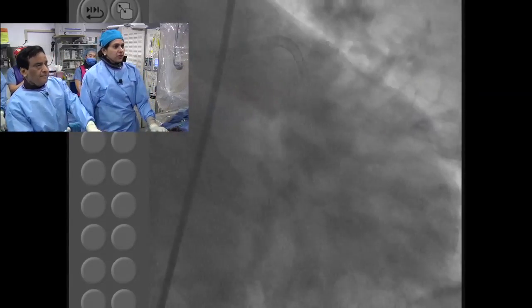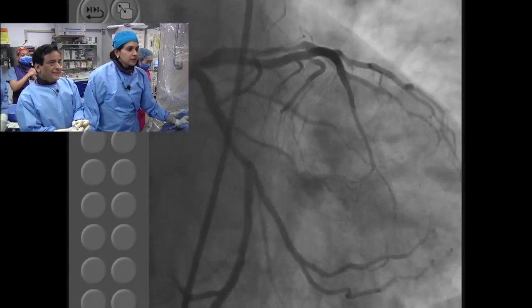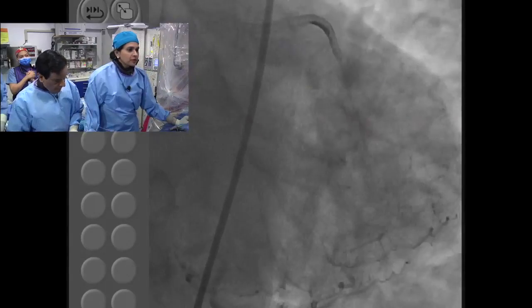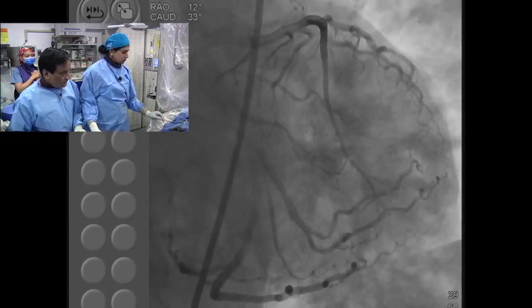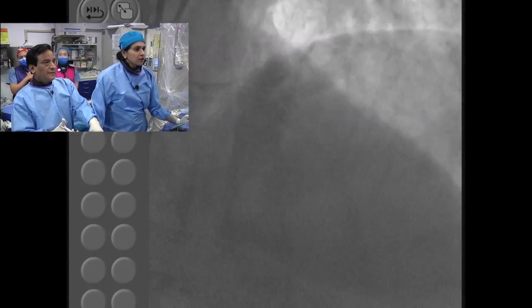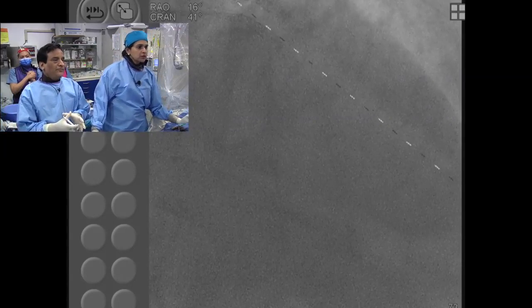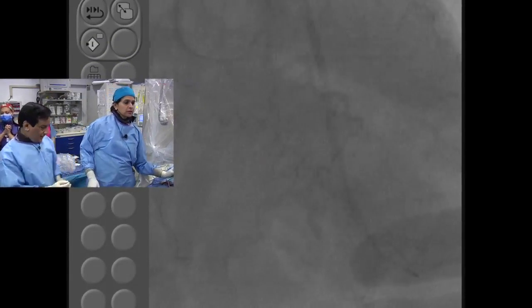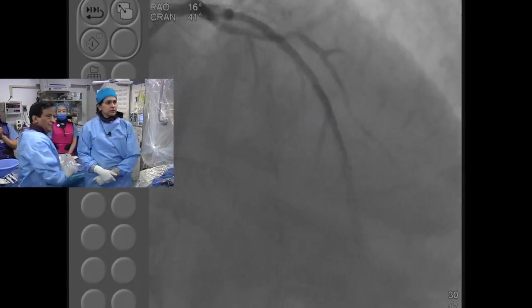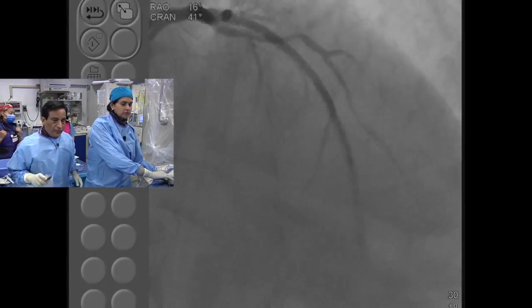We gave a lot of vasodilator therapy to the distal vessel. It's plumped up, ready for the final shot. Two final shots. Yes. Excellent. And one more. So, 3.0 tapering down to 2.5. Yes, 3.0 to 2.75 and 2.5. Wow. Beautiful result. That's fantastic with all the branches. Absolutely outstanding. Good. Now we can just complete it because we are reaching our time.